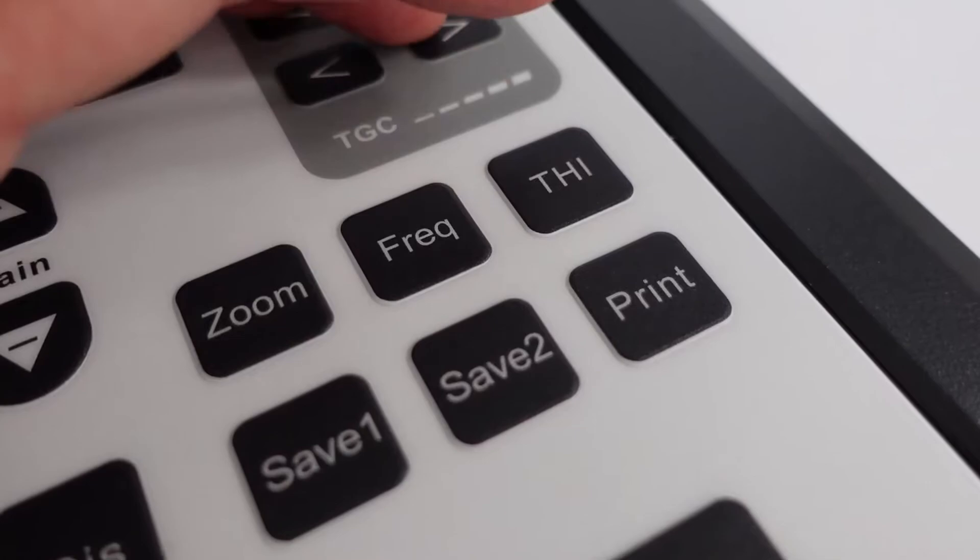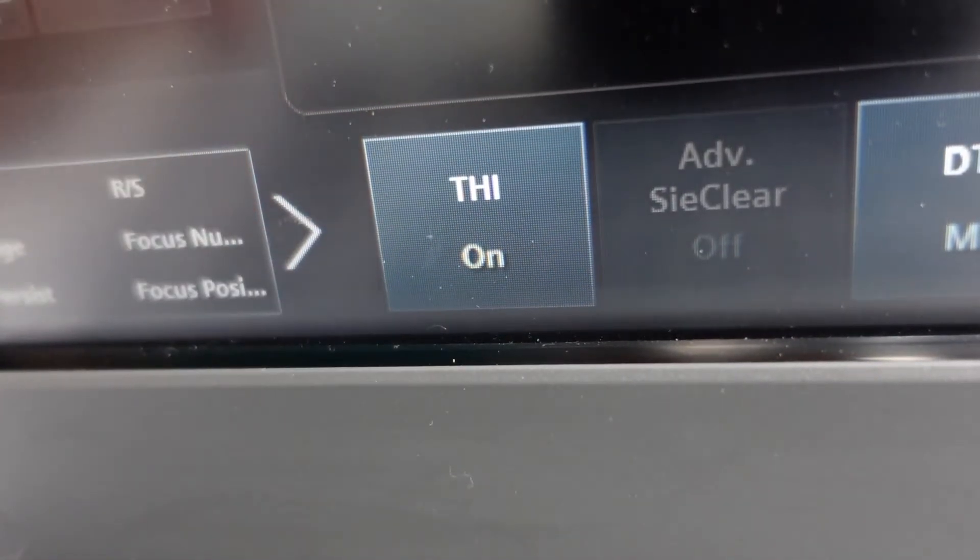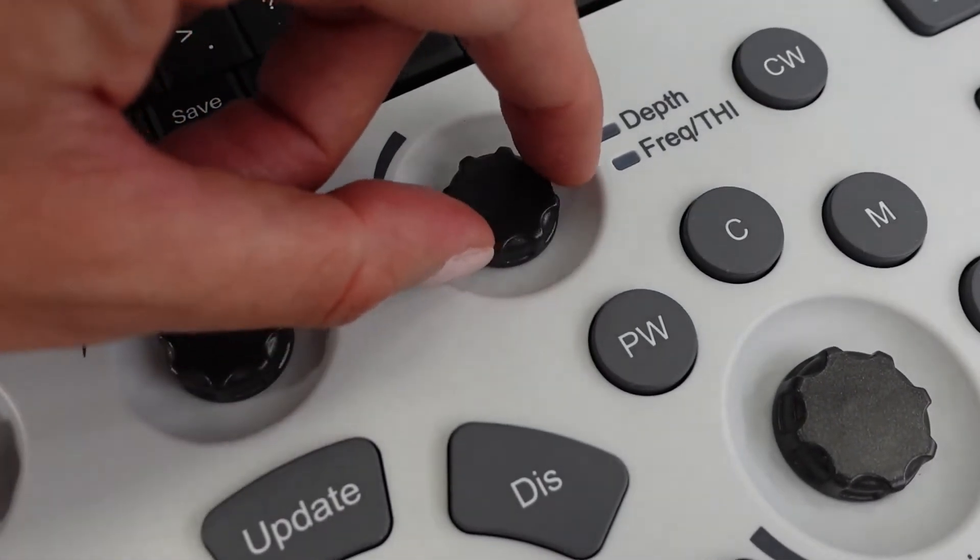Whether or not you are interested in how tissue harmonic imaging actually works, the important thing to understand is the difference it can make to your imaging. To turn harmonics on, you may have a dedicated THI button as found on the Apogee 1000 Lite or the Siemens P500. Or you may have a frequency knob like this on the Apogee 2300, and when you continue rotating it, your scanner automatically jumps into its harmonics range. Take a look next time you scan, as you may even have been scanning with harmonics on the whole time and not even realised it.